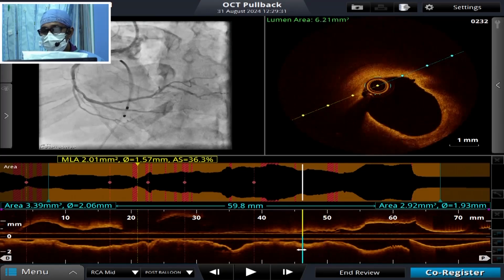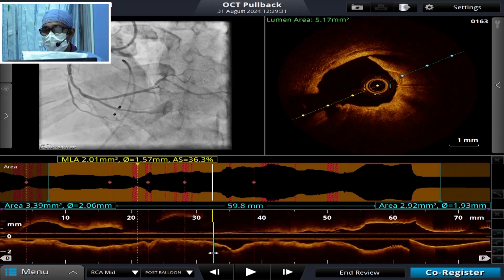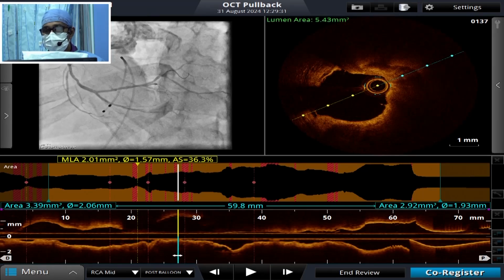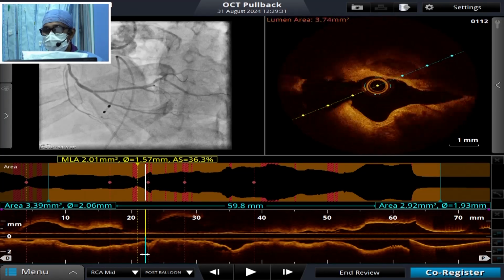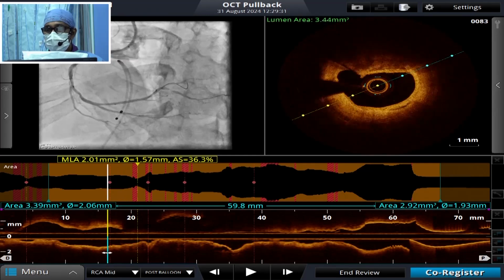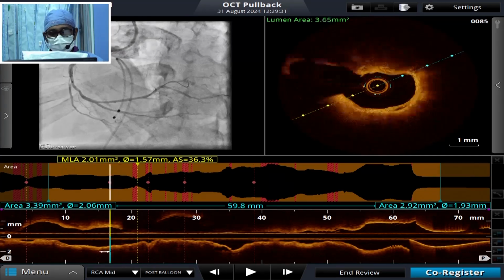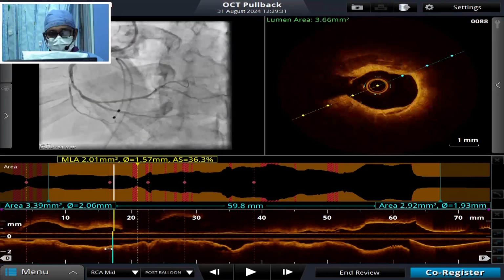We do not see a lot of cracks produced inside the calcification, primarily because it was more eccentric, unlike the other one wherein we saw a huge amount of concentric calcification. Here certainly the stent is going to expand, we are sure, with probably some amount of eccentricity. If you had used an IVL, probably we would have seen some cracks in these areas also. And we didn't actually dilate these particular areas. We dilated only the mid portion of the critical lesion.